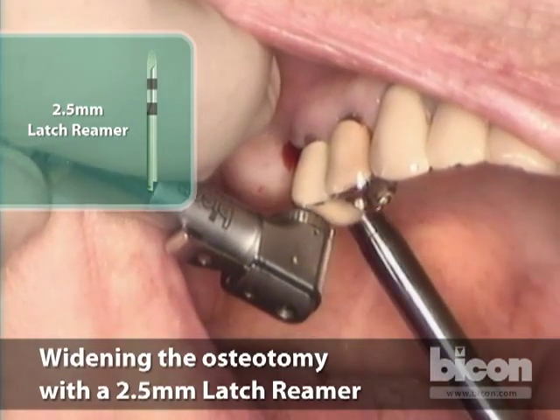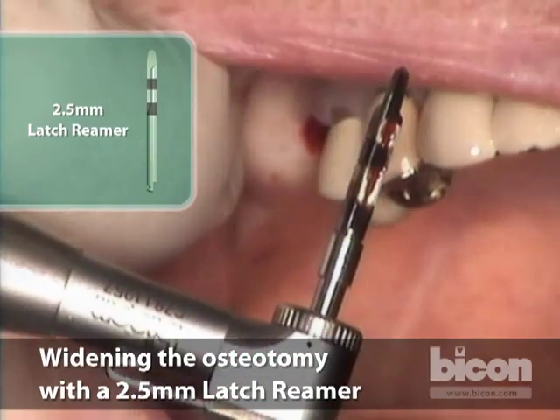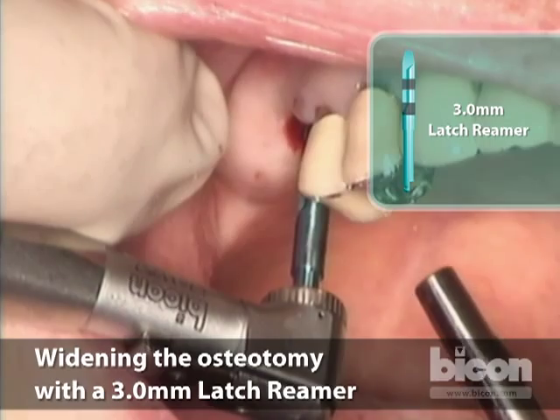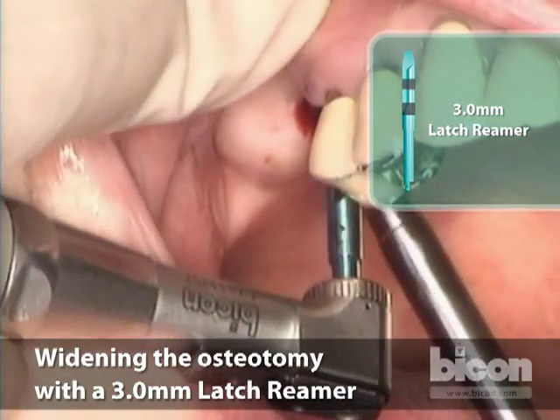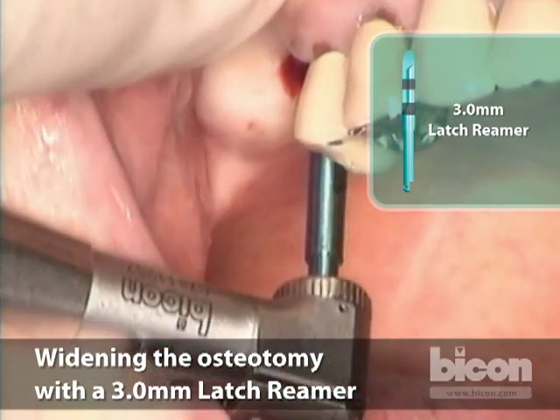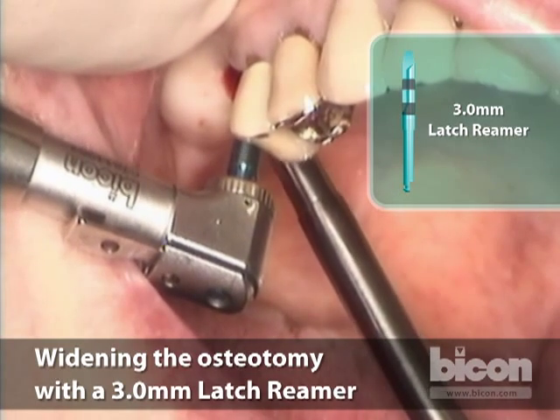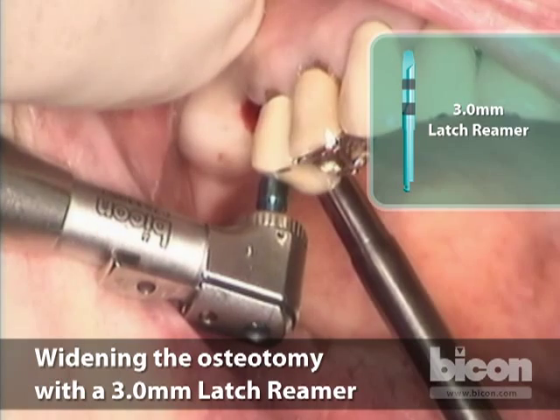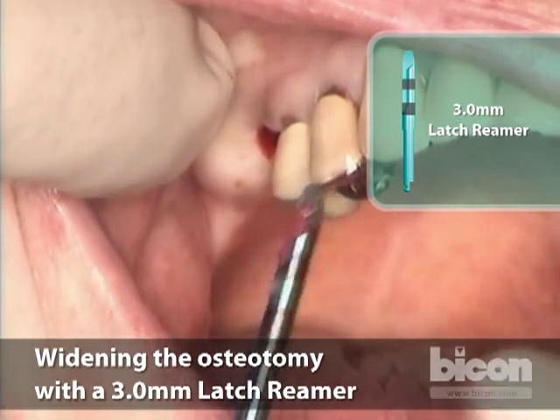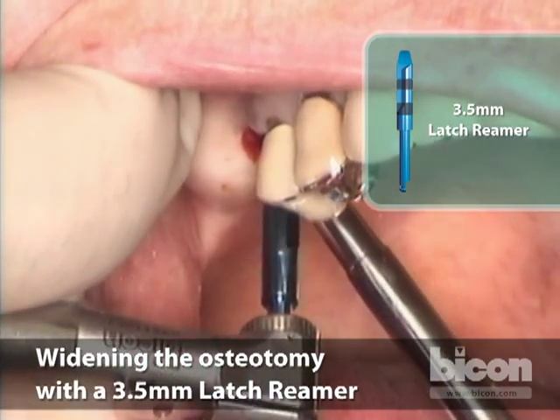I'll find the mouth of the osteotomy and push it in. In this case we are not going to find a lot of bone — we didn't expect that — but as we get wider we will get to the proper level. One by one we will carry our osteotomy to the proper depth. Keeping the index finger against the buccal plate allows you to have a tactile sense of where your implant is going. The initial penetration with this reamer went into the socket of the buccal root; I'm going into the pyramidal bone between the three roots, which gives better stability. I'm starting to see a little bit of bone even at the 3 millimeter diameter level.